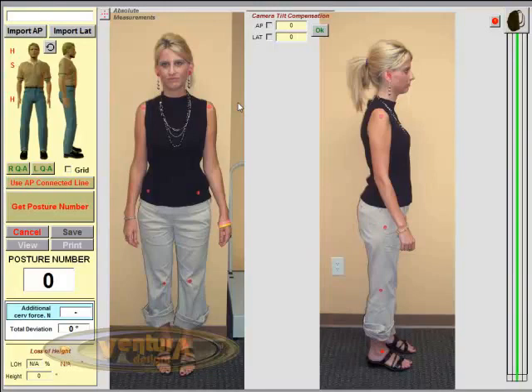Well, how frequently would you use Posture Pro to assess somebody's posture if they were compliant? The answer to that is really dependent on what you're doing for the correction. And I've had a discussion with Alex about this, and the heavy emphasis being placed on the anatomy trains concept, which honestly I'm just now learning about, and I'm not going to pretend at all that I know hardly anything about it.